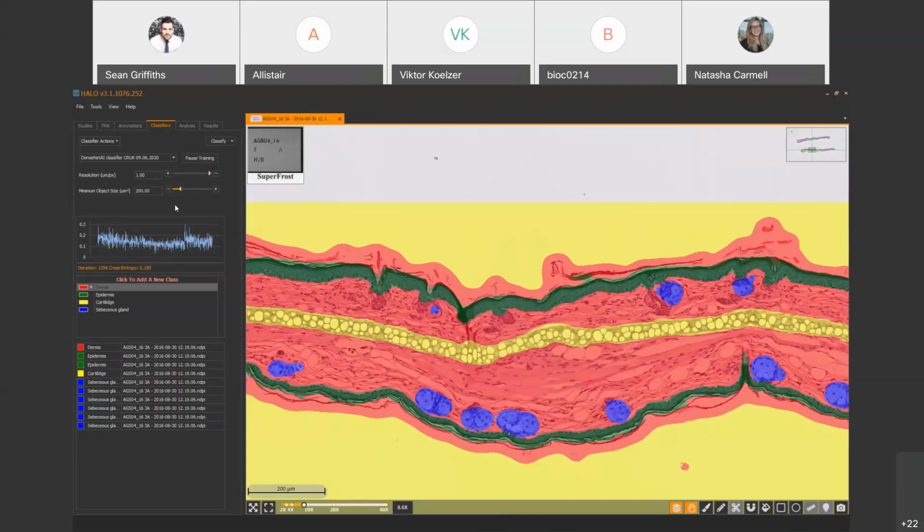That was a feature which people had requested during tissue classification. Say that one of these was incorrect here that we see in front of us, could you just right click and remove it? You can't do that on the nuclear either. You couldn't do it on this and you can't do it on nuclear. Okay, that's brilliant. That's all my questions.